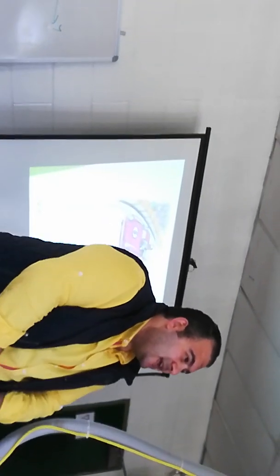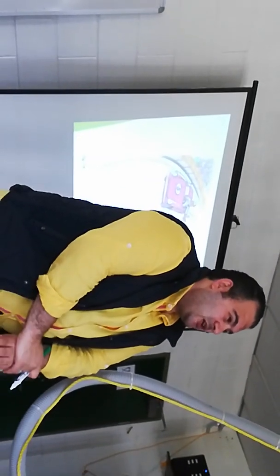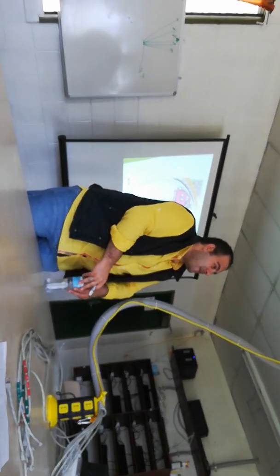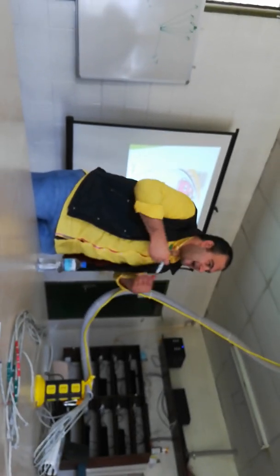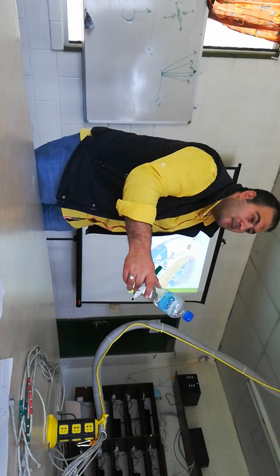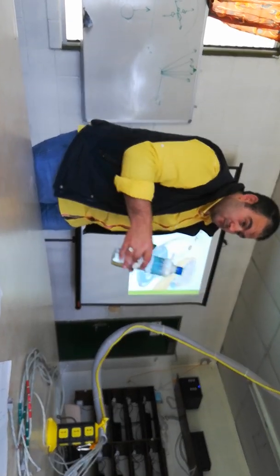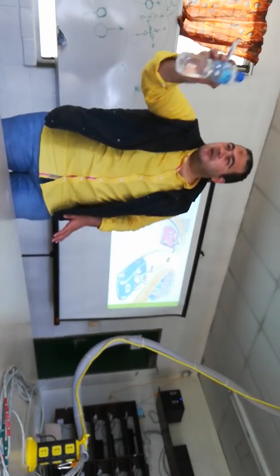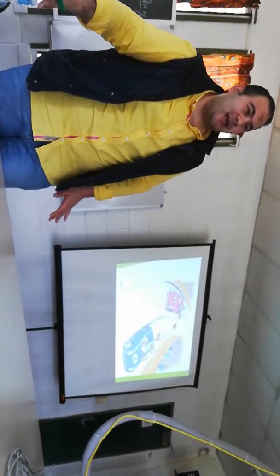Now, we placed the patient inside the MRI machine. What happened? Before putting the patient inside the MRI machine, what was inside his body? The protons are randomly distributed. Yes. When we put the patient inside the MRI machine, what happened?